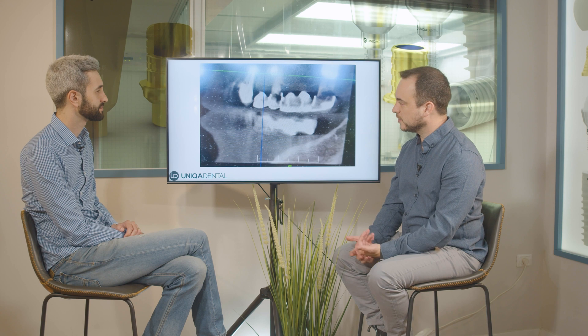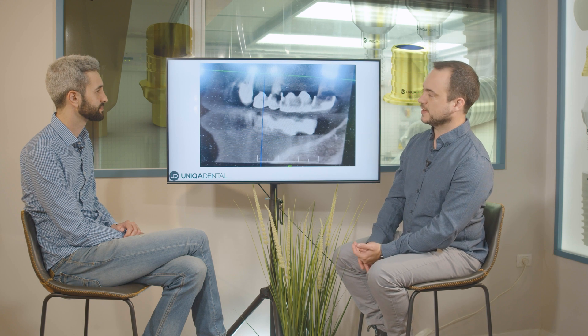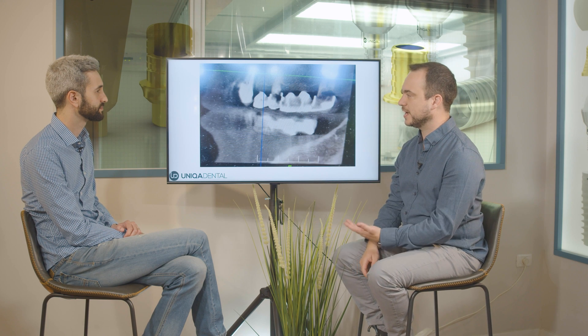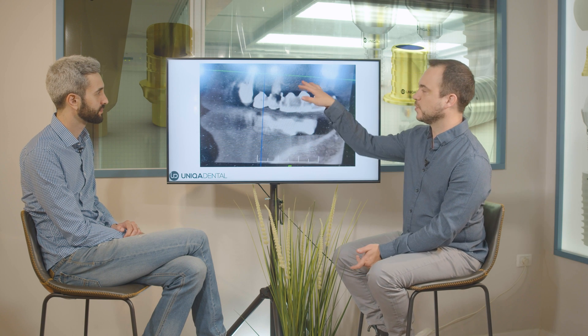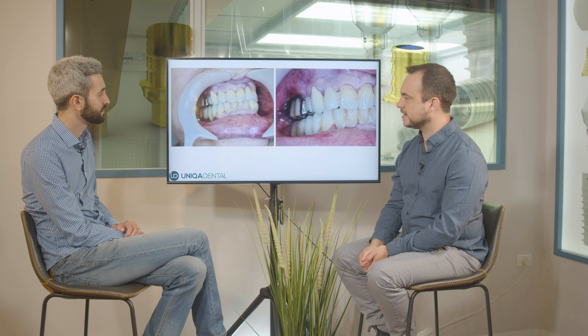The first thing we want to do is place implants in the bone where we don't have the teeth. We have quite good enough bone for two implants here and one implant here — that will be enough for this kind of restoration. As you can see, this is the metal bridge.